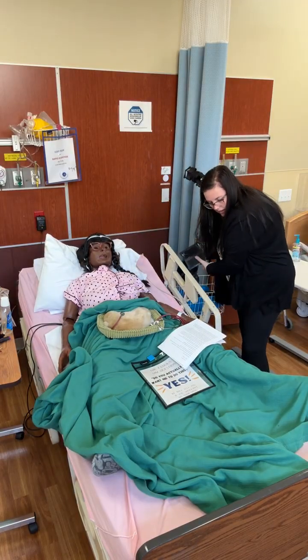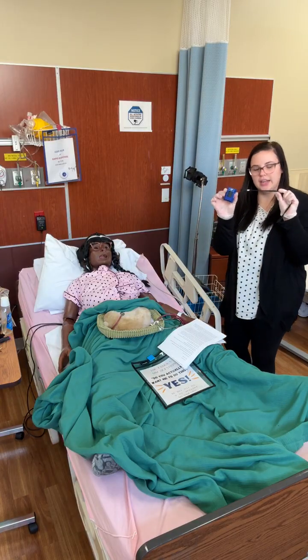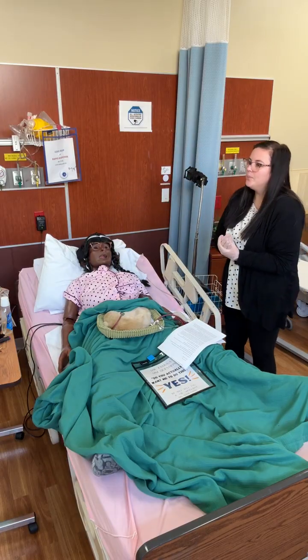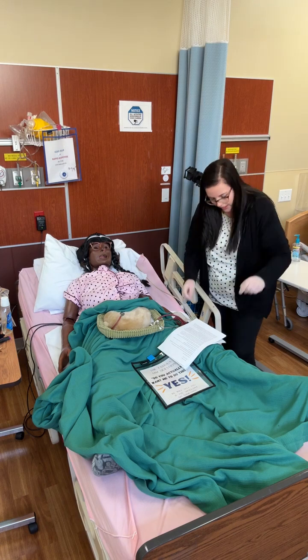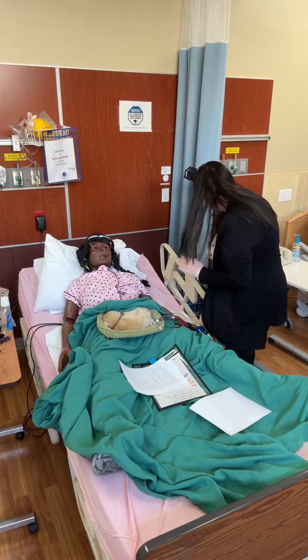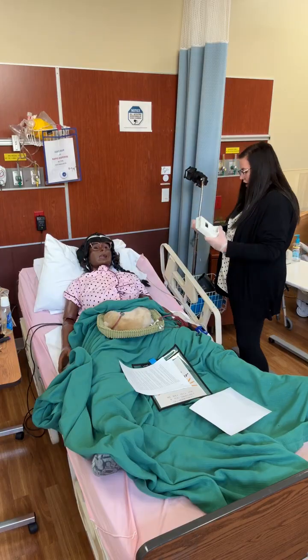And then we need an SpO2. So we're going to take our pulse oximeter right here, put it on her finger, and say, sim question, what is my SpO2? SpO2 is 94%. So we'll write that on the board. And then we need to get a temperature. All right, Carla, I'm just going to take your temperature. Can you put this under your tongue for me?